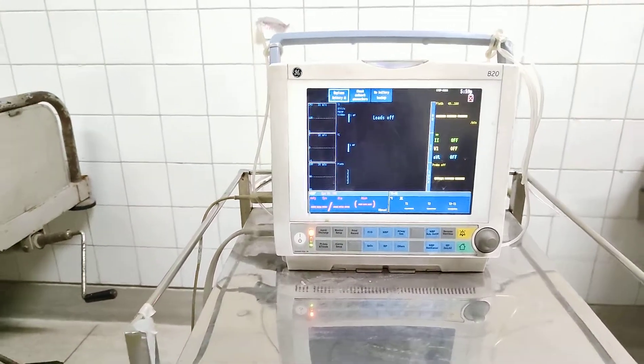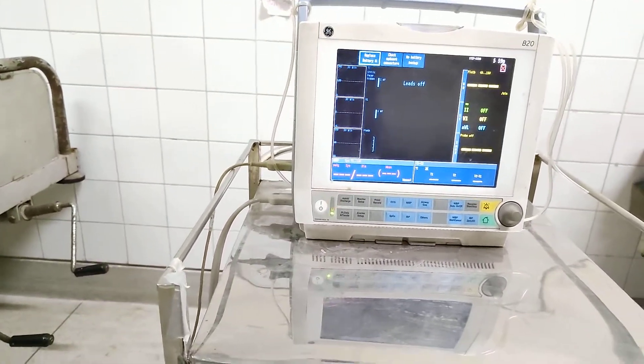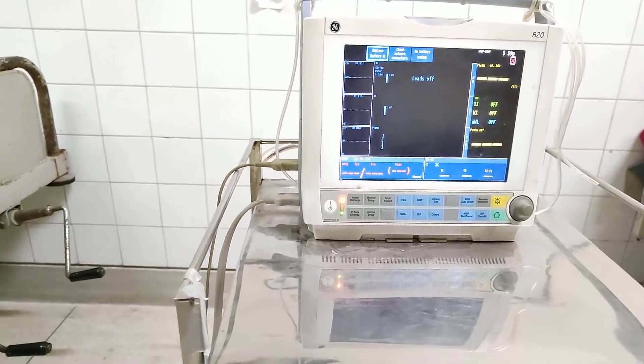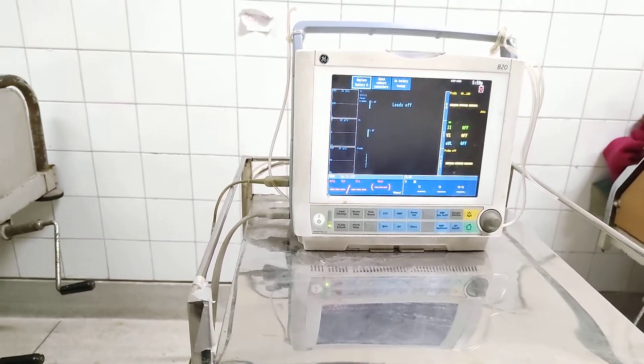What can we see in this video? We can see the patient's heart rate, pulse rate, saturation, oxygen saturation, SPO2.